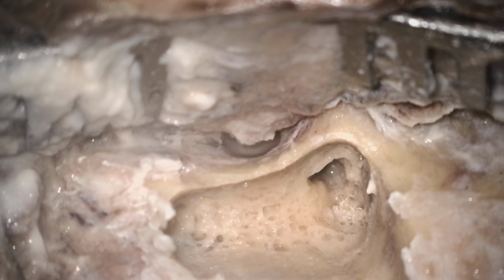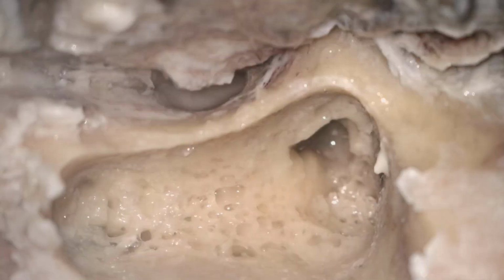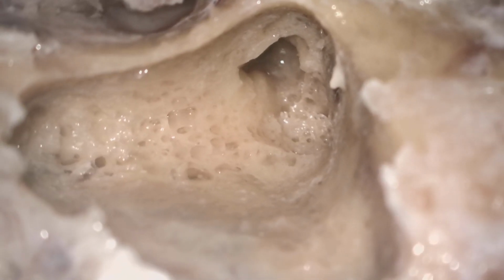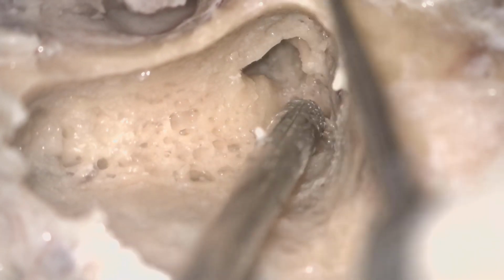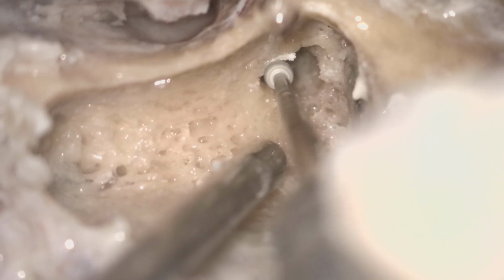Okay. So in that position, we will use some small bar to delineate the incus. And for that reason, we have increased our magnification to 0.6 so that we can easily visualize all the important landmarks. So this is the lateral semicircular canal, and here we have a diamond bar. Sometimes we do this using a diamond bar.